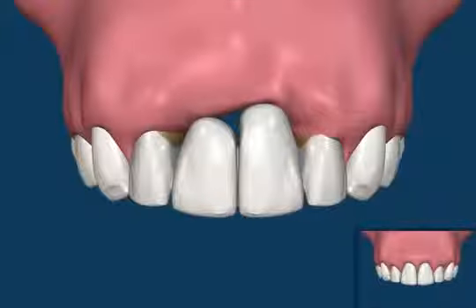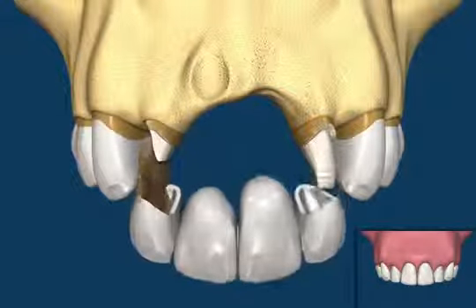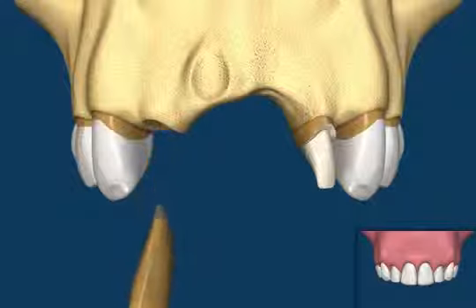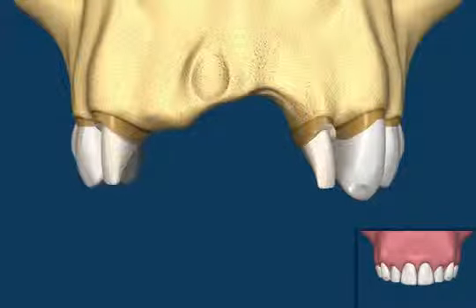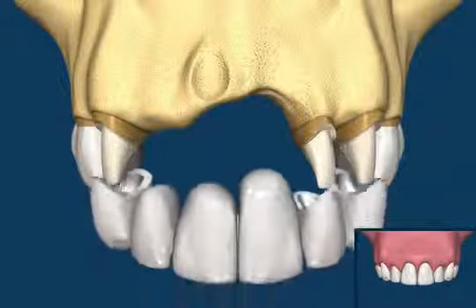Comparing the two results now clearly shows the destructive possibility of the bridge with time. Since the number of teeth to support has doubled, there is now even more of a chance to have the same consequences happen to the next tooth. The bridge will once again have to be removed and more teeth prepared to hold the now 6-unit bridge.